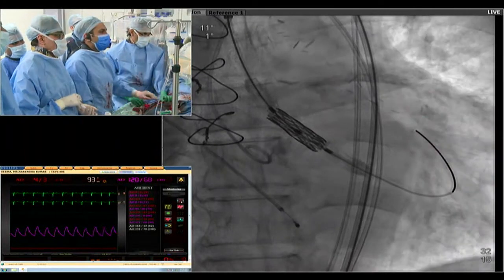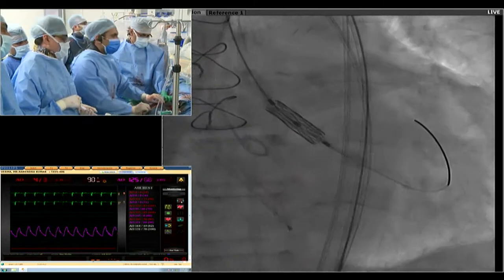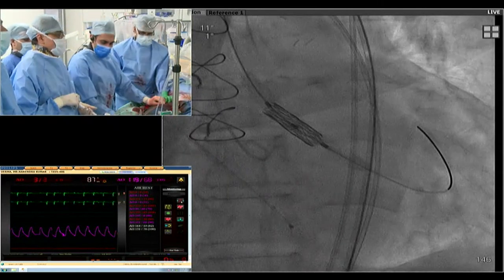I think I'm happy. What do you think, Sanjeev? Yeah, this is good actually. So I'll hold here. We might do some adjustments on the fly. Dr. Sanjeev is going to inflate, so we'll wait for the pressures to come down. Okay, I'm going to give some commands.